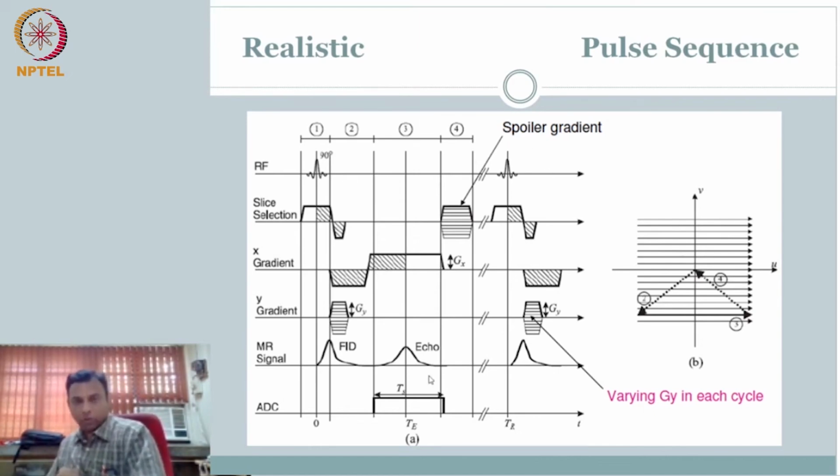I would expect you to also understand this in relation to how you are able to travel the Fourier space. This will be the art. If you understand this, this is the scope of the lectures. I would at least like for you to understand the sequence. Given the sequence, you should know how to tease out and understand where you are moving in the UV space.